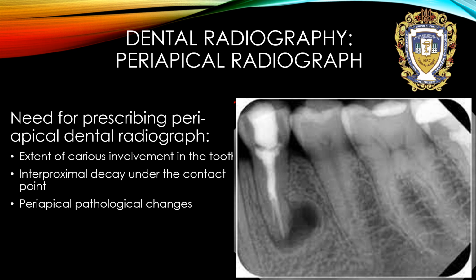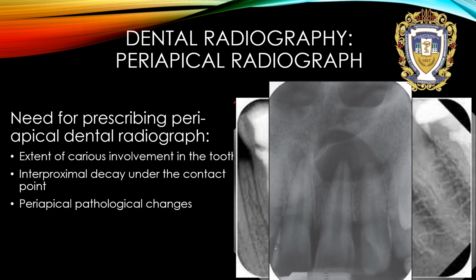Another X-ray. It is a typical cyst with clearly visible borders. Another periapical change. It is a cyst too. In this cyst the apices of two teeth are involved, tooth number 2-1 and tooth number 2-2.